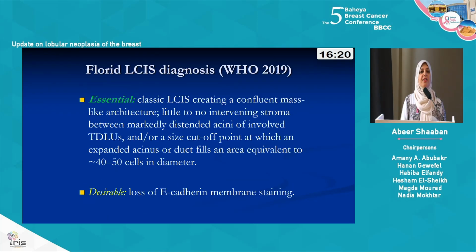So what about the one in the middle? That's the most recently described type, which is called florid LCIS. And this is the latest WHO 2019 definition. So the essential criteria are classic LCIS. And when we say classic, this means type A or type B. It's not high grade. It's really important. It's not high grade nuclei.